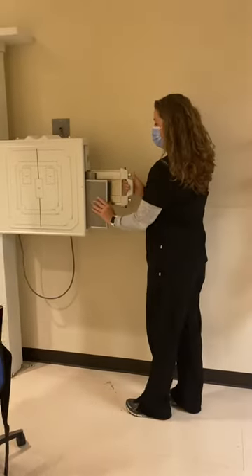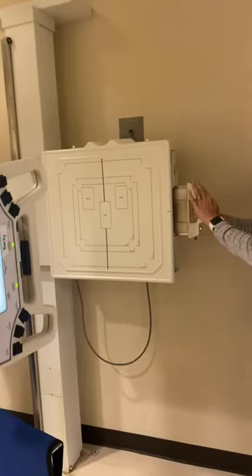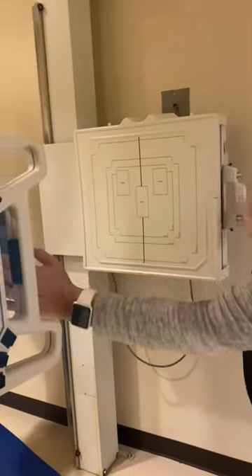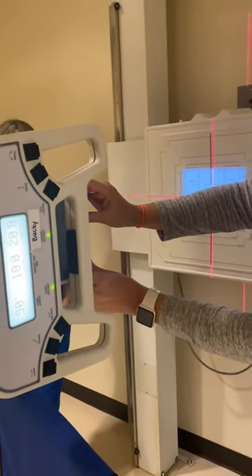Now our technology will demonstrate the PA oblique shoulder. We place a 10 by 12 transverse in the wall bucky. We are at 40 inch SID. We're setting our collimation to 8 by 10.